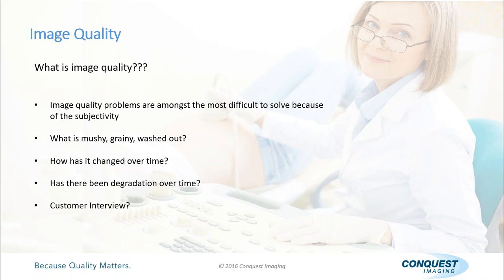I went in to work on an old Logiq 9. And the old Logiq 9s had a recurring problem. It's known. They get a color artifact on them. And the way you fix a color artifact is really simple. You go in, you kick the right-hand side of the machine. And you don't kick it really hard, but you kick it and the artifact goes away.